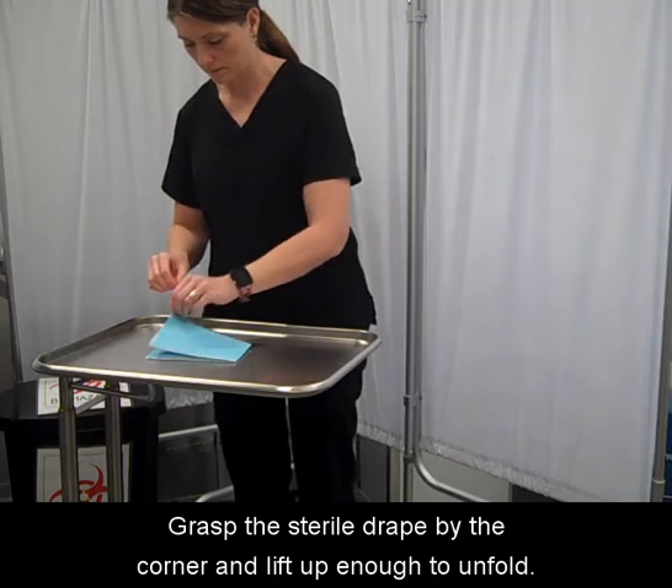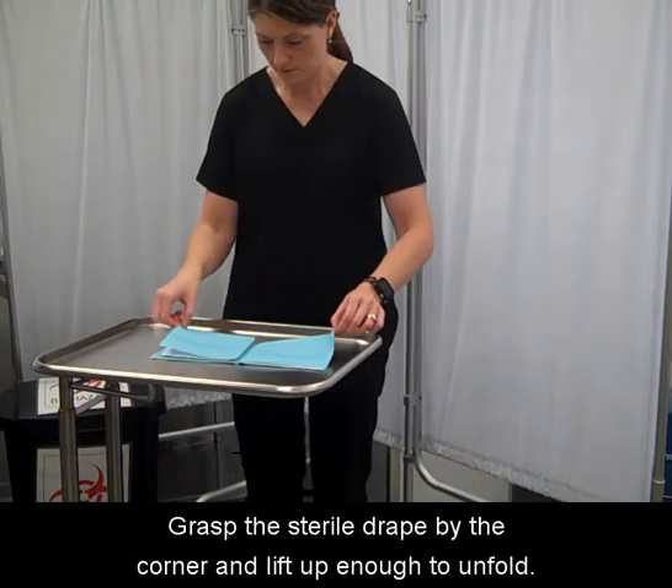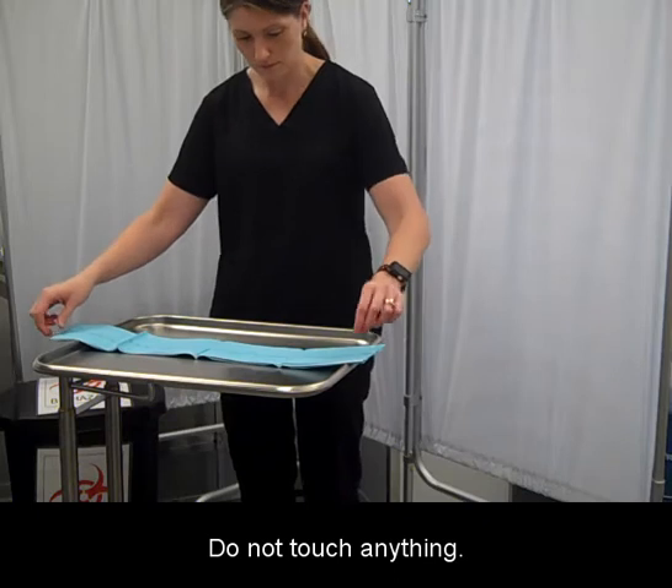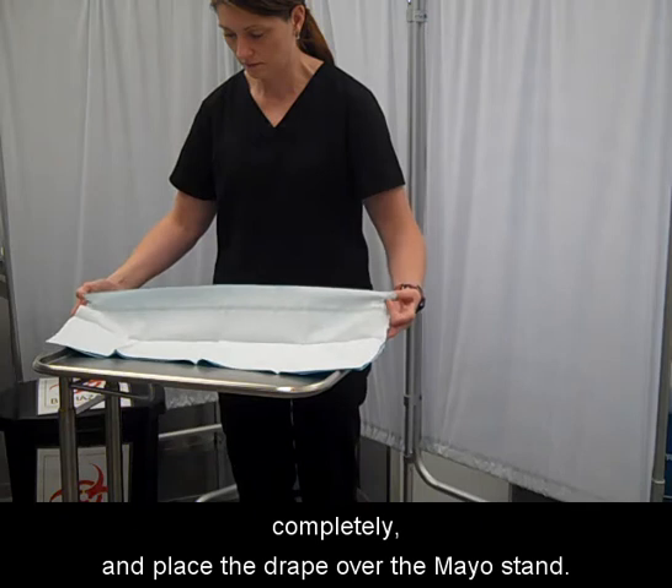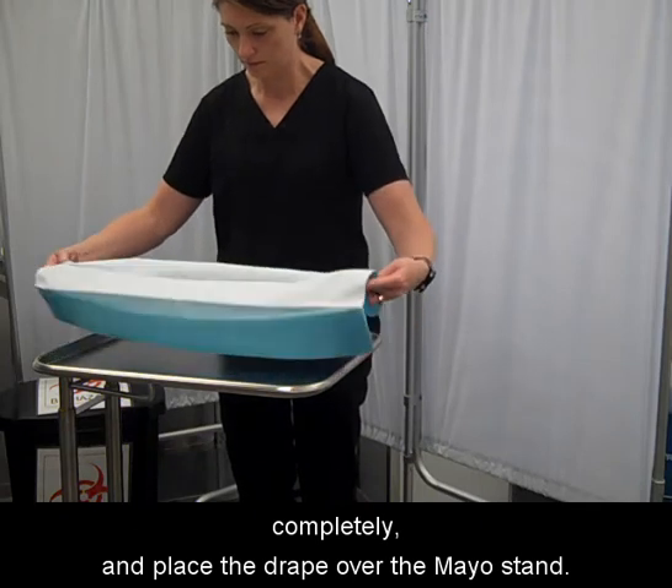Grasp the sterile drape by the corner and lift up enough to unfold, but do not touch anything. Grasp the opposite corner, allow the drape to unfold completely, and place the drape over the mayo stand.